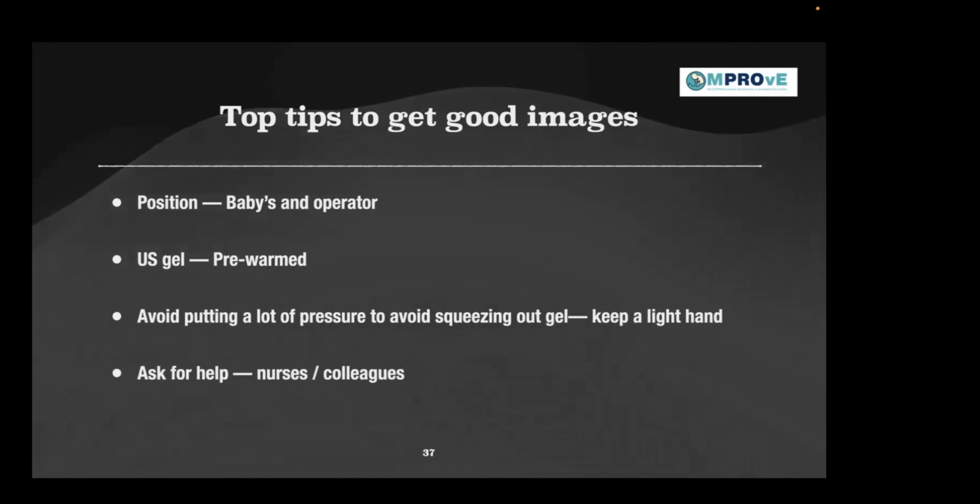And then, of course, always ask for help, be it your colleagues or nurses, to position the baby. As Alok has mentioned multiple times, it's very, very important to keep the baby contained, so that the baby is not fighting with you or the scanner, so that you get good images.